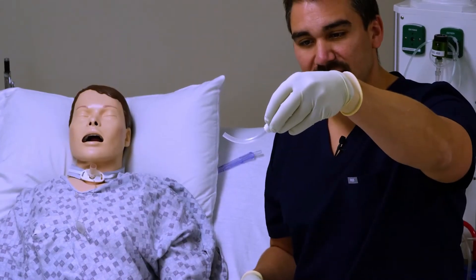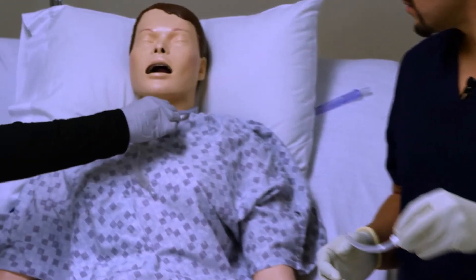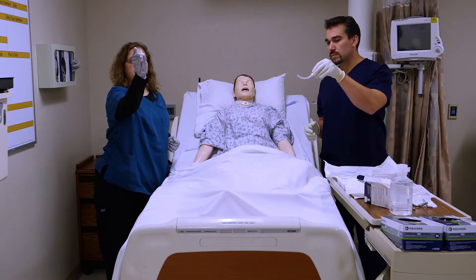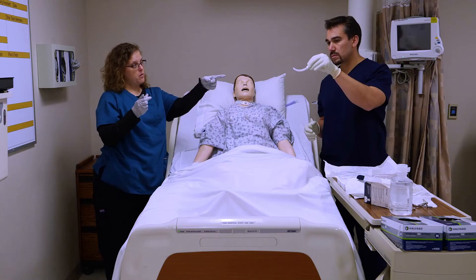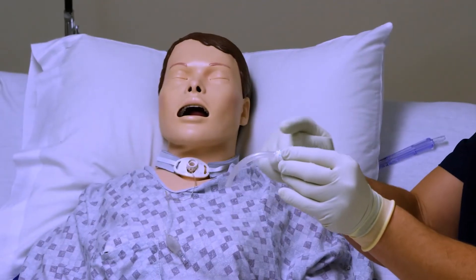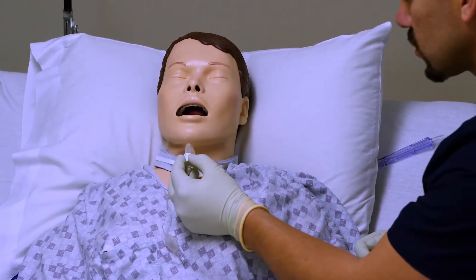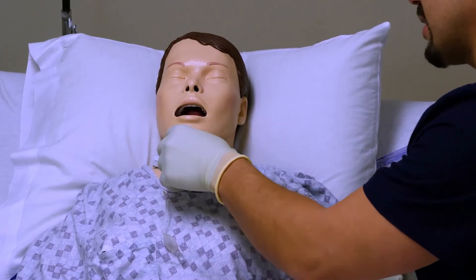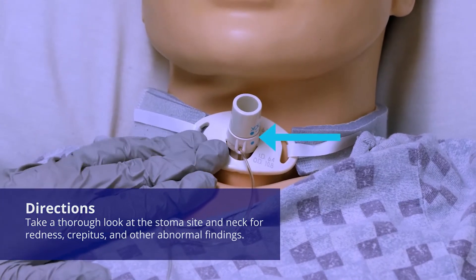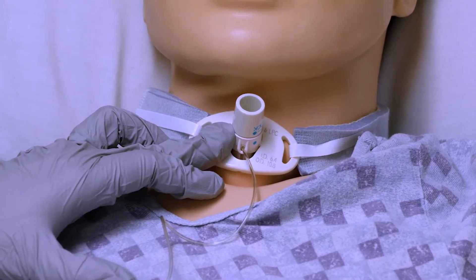The really cool thing about having a disposable inner cannula is that we don't have nearly as much cleaning and work to do. I can just pop this one out and then Mike can pop the new one back in. This one has little squeezies and that's how we clip it in, but Mike's has one that just screws in — it's not any more complex. He's being real careful to just hold the outside because we don't want to introduce more bacteria into the lungs. After you feel it's locked in your hands, you'll also notice two little dots on the side that line up and show you that it's locked in place.